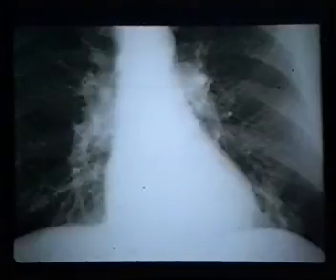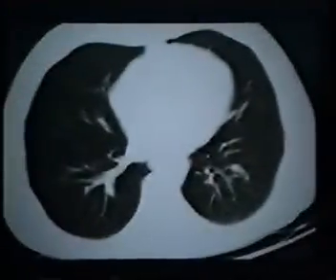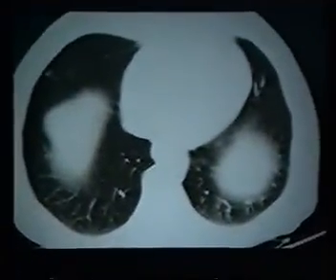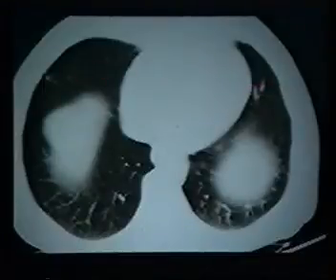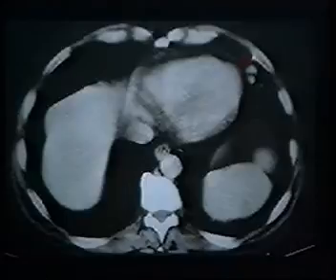These can be somewhat more subtle. I'll show you another example of a patient who had some densities at the left lung base. I think you can see there are a couple of large vessels that we can identify in the lateral radiograph, and perhaps you can suggest the diagnosis from this pair of images. If we look at sequential images now, you can see that on this image, I think it would be very difficult to identify any abnormality, but notice that these two vessels can be traced out into the periphery of the lung, and they maintain their size. So if you're going to look for anomalous vessels in the lung, you really do have to look at sequential images. You can see here that these are quite larger than anything in the corresponding middle lobe. And in fact, we can trace these again all the way to the periphery of the lung, and a bolus of contrast shows us quite clearly the presence of an AVM.